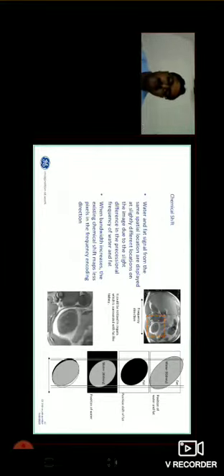So there are two different types of chemical shift artifacts again. This, we can say, is a type 1 chemical shift artifact. I'm not going very deep into the artifact section; my colleague will go deeper. The type 2 chemical shift artifact we can see in dual echo imaging, in-phase and out-of-phase imaging. In the out-of-phase imaging, we can see the dark rim artifacts in the organs. It's also called the India ink artifact or etching artifact. This is one of the artifacts which comes only in the frequency direction.